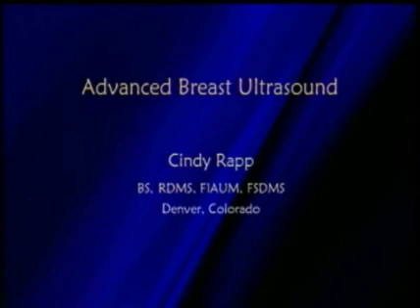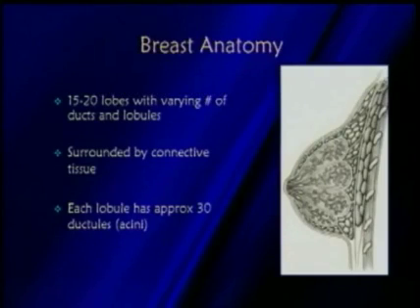We're going to be talking about advanced breast ultrasound today, particularly looking at intraductal lesions and sonography of implants. Looking at breast anatomy, basically there's 15 to 20 lobes within the breast. These are a varying size of ducts and lobules. They're surrounded by connective tissue, and each lobule has approximately 30 ductules or acini in each of them.